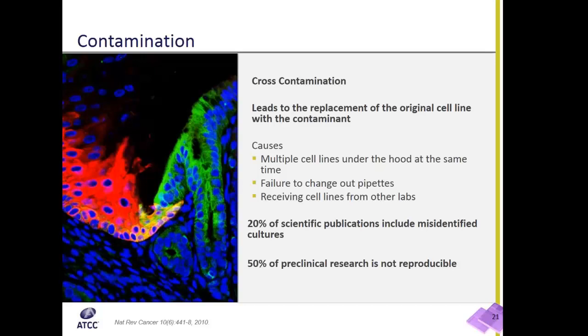There are several common causes for this kind of contamination. Researchers often contaminate their own cell lines by working with multiple cell lines or cell types at a time. This often occurs when using the same pipette tip or aspirator within vessels containing different cell types. We recommend only working with one cell line at a time under the hood if at all possible to avoid this.